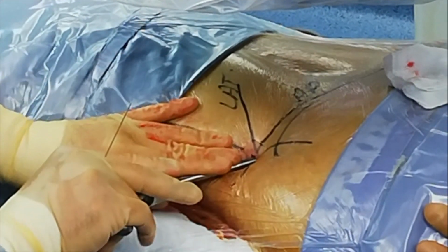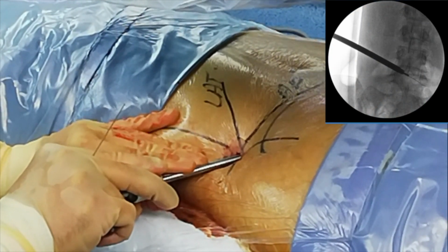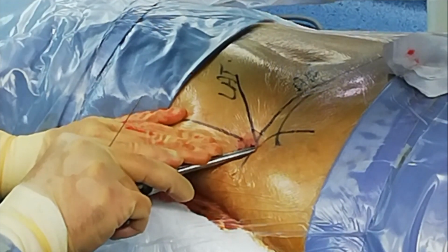Push your hand down. X-ray, please. X-ray.